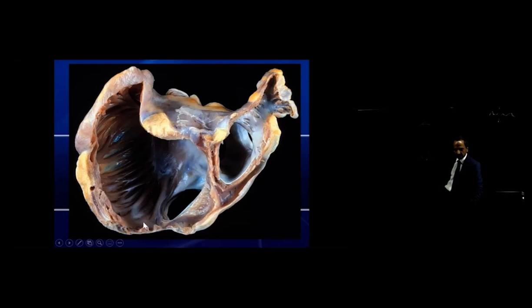So we get one layer like this at the plane of the pectinates, and we get another layer that is the plane of the vestibule, and this gives an impression of endocardium versus epicardium. Fiber orientation of the vestibule is different from the fiber orientation of the pectinate. So if we do a high density map, it looks like conduction from one site is coming to another, giving the appearance that we have some kind of connection. But in reality, in the region of the cavo-tricuspid isthmus, that's not an issue.